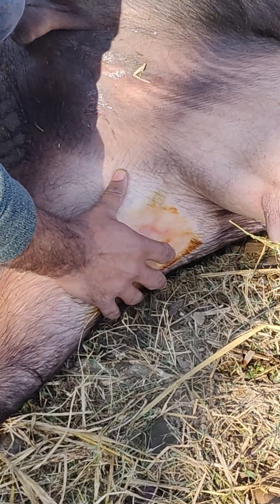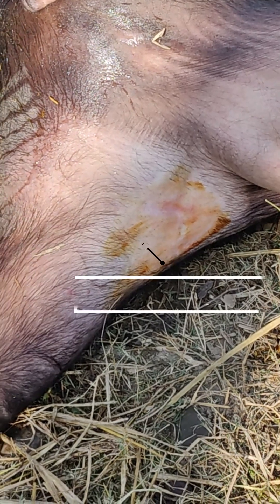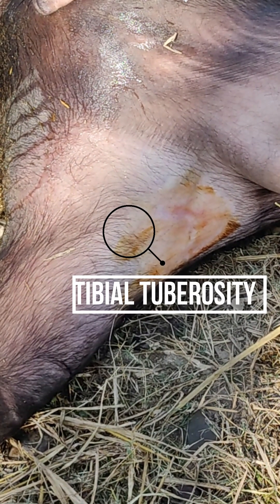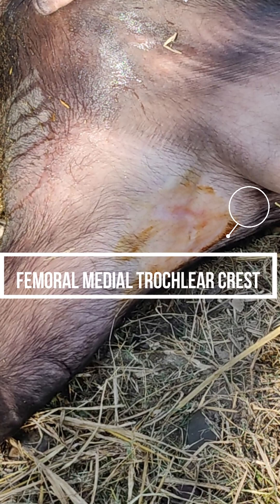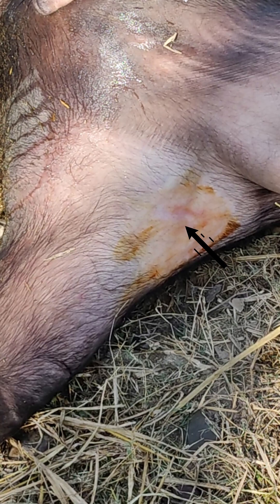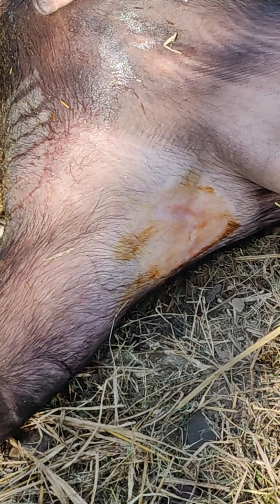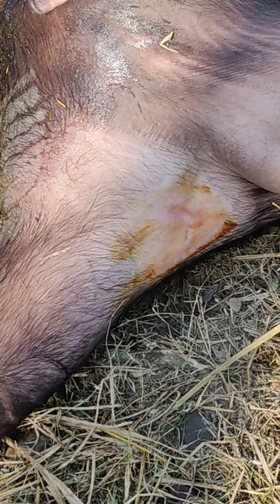Now for identification, the thumb is placed on the tibial tuberosity while the finger is placed on the upper spot of the femoral medial trochlear crest, and the midpoint is established using the index finger. This point is the medial patellar ligament.